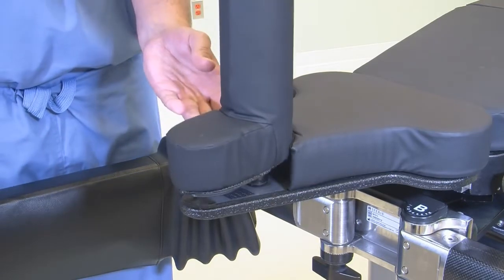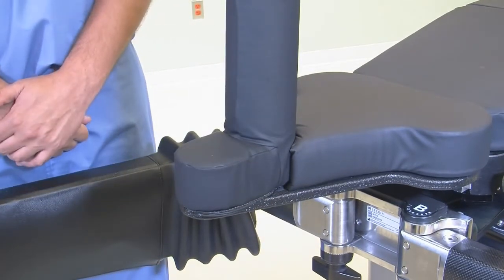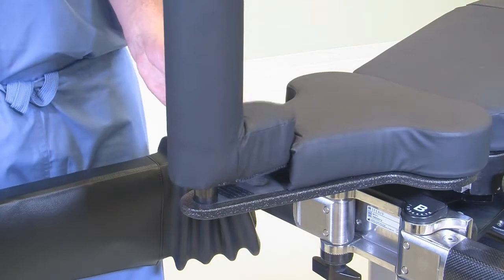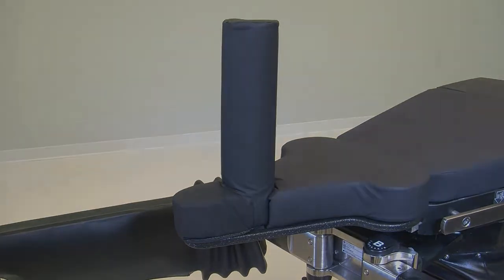Next, place the perineal post and pad in the appropriate hole on the sacrorest. Perineal post pole placement is determined by the surgeon's exposure requirements. Follow these steps to ensure proper sacrorest and perineal post placement on the OT1000 series tables.